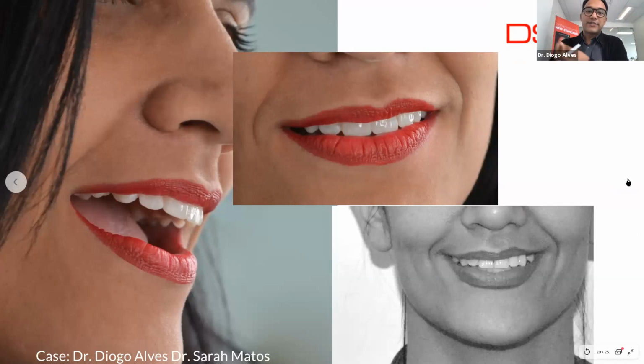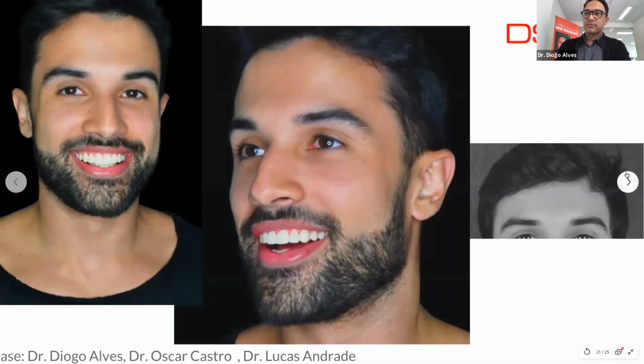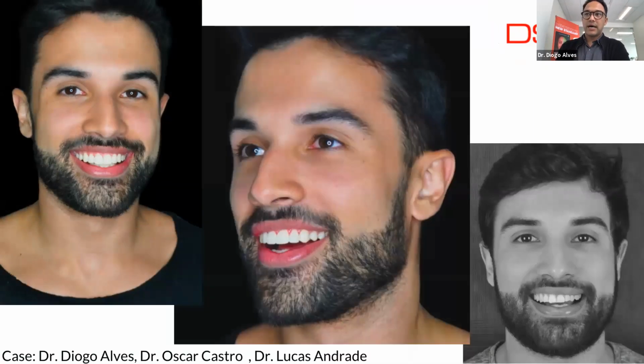It looks really good. That's what we want to do. We want to make composites that look like real teeth. Right? It looks harmonic. It looks beautiful. We have here another case, 10 composite veneers done with DSDApp.